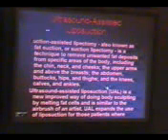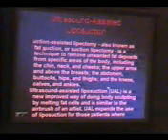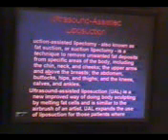Then another idea is ultrasound assisted liposuction. How does ultrasound assisted liposuction differ from traditional liposuction? Suction assisted lipectomy, also known as fat suction or suction lipectomy, is a technique to remove unwanted fat deposits from specific areas of the body including the chin, neck and cheeks, the upper arm and above the breast, the abdomen, buttocks, hip and thighs and the knees, calves and ankles.